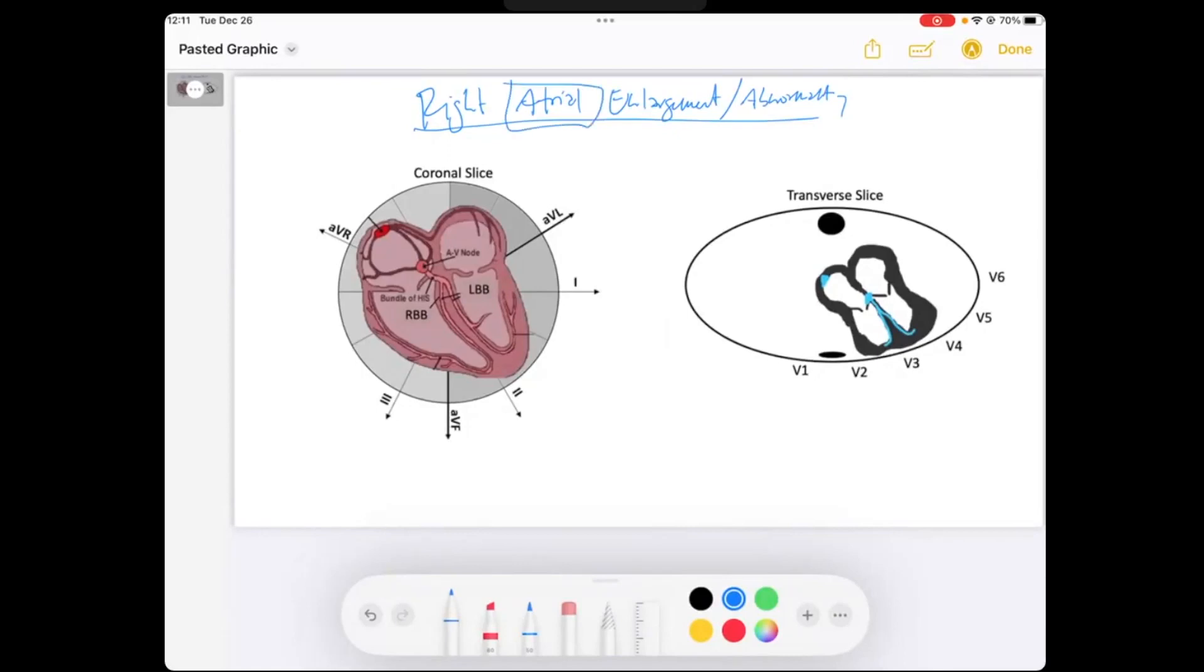We're talking about the right atria. So we're going to be looking at our P waves as the P waves are showing atrial depolarization.